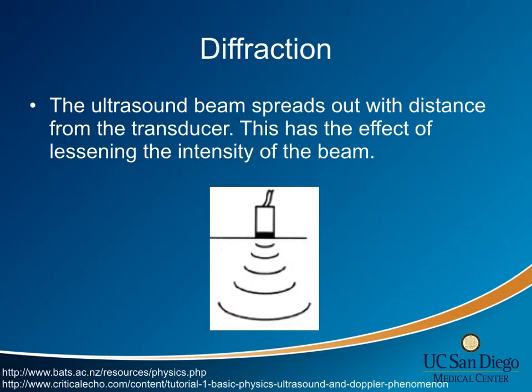Lastly, and probably most intuitive, is the idea of diffraction. Basically, attenuation is increased and hence penetration of the beam reduced as the distance traveled from the transducer increases.